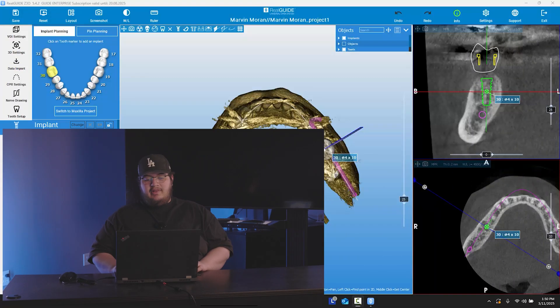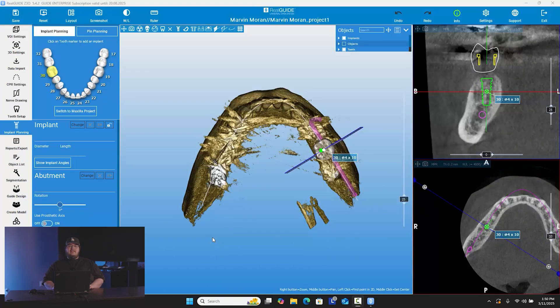Hi, I'm Marvin and welcome back to another Workflow Wednesday. In this Workflow Wednesday, I'm going to be showing you guys how to make a surgical guide on the RealGuide treatment plan software. So right now we have RealGuide open.